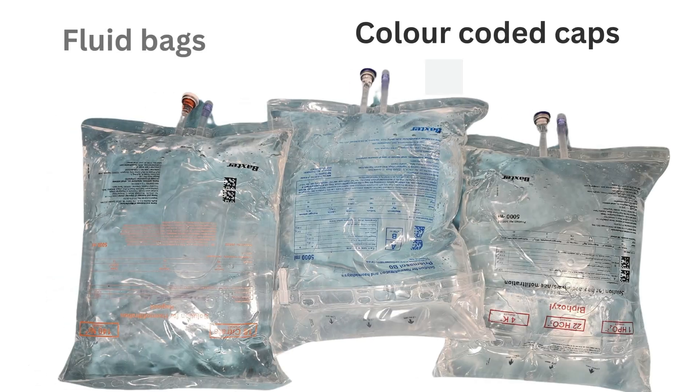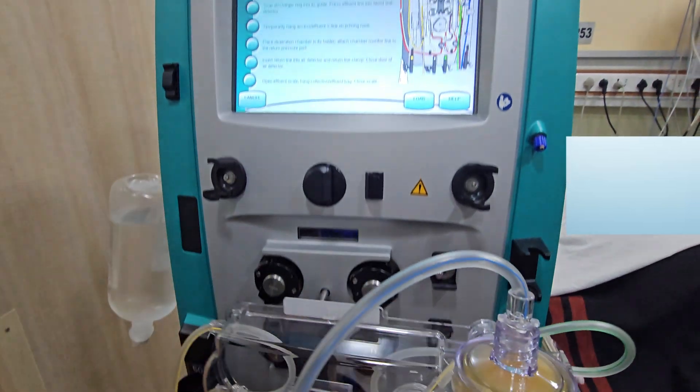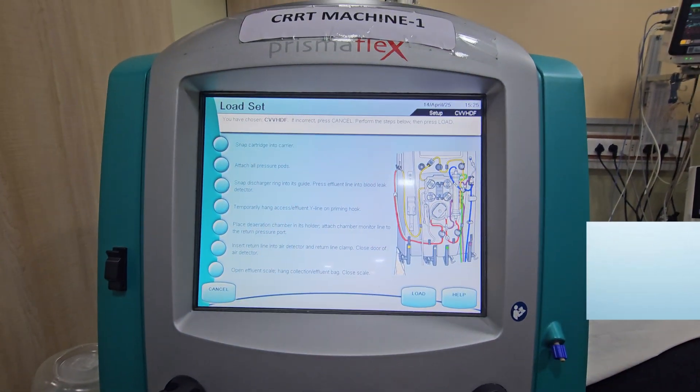Dialyzer fluid bags are prepared. The filter set is loaded on the machine.